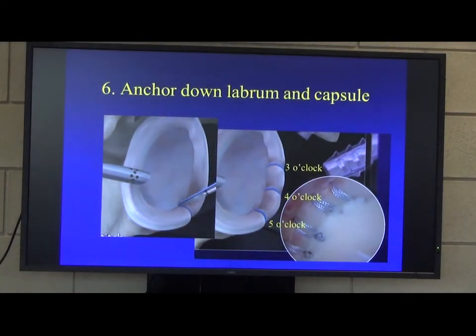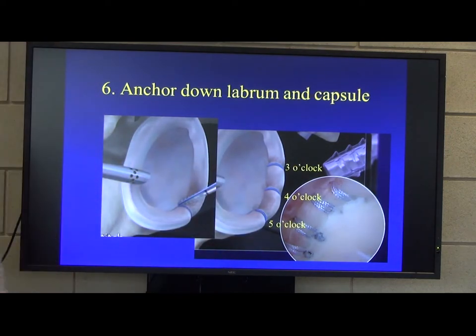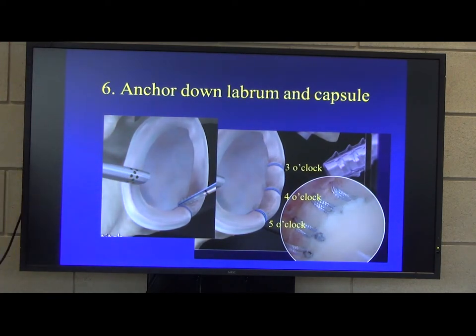Once you've done that, you've got to reattach the labrum using anchors. We tend to do anchors at 5, 4, and 3 o'clock in that order. If you're going above 3 o'clock, which is usually determined by the upper level of subscapularis, you're probably not repairing much of the capsule, and those anchors up there become slightly redundant.